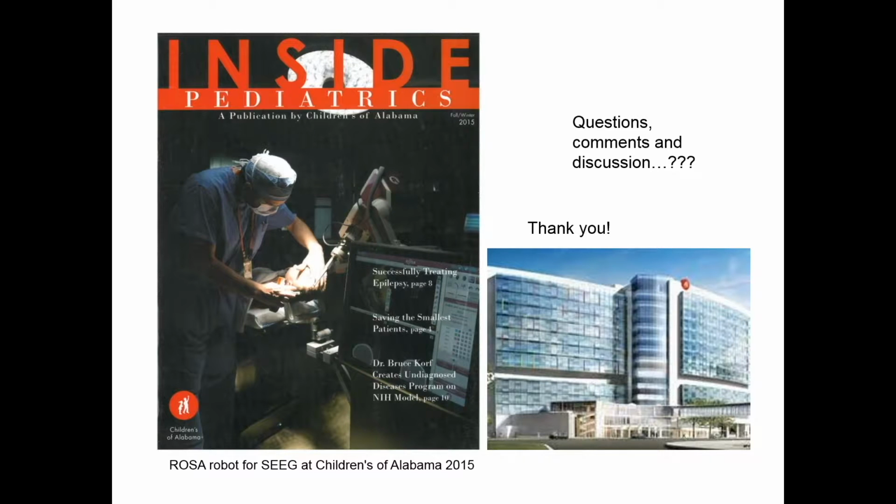A couple of things. One is that I try and avoid that area of the skull, the squamosal part of the temporal bone. If we have to come in through that area, use the shortest anchor bolt that's available, which for what we use is a 25 millimeter anchor bolt. I take that into consideration when planning, because the first little baby that I did, all my trajectories were off about an additional 6 millimeters, the same amount, and I think it had to do with the depth of the anchor bolt relative to the thin skull.